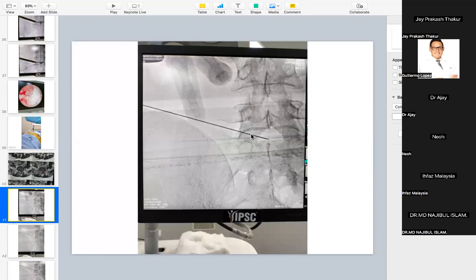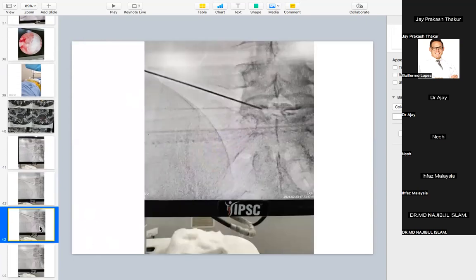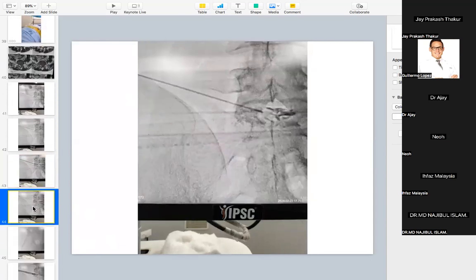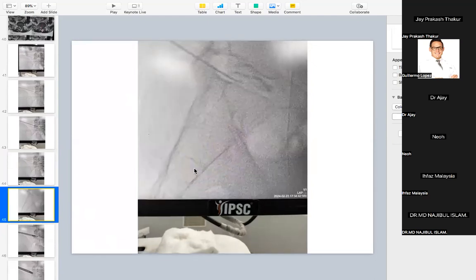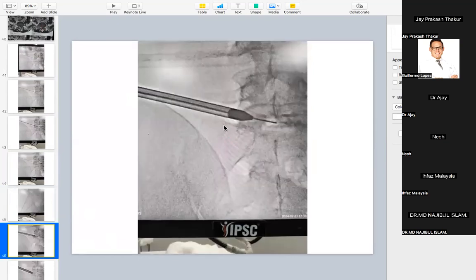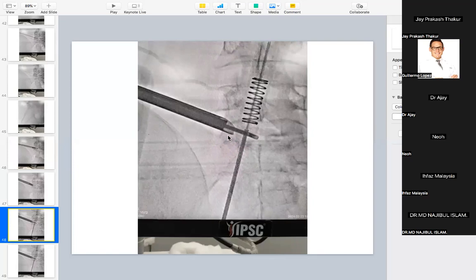Same thing we'll do. Okay, so midline, just above the ilium. Just above the ilium. Okay. Hit the SAP. Go inside. Do the arthrogram, discogram. Check lateral. Here is the posterior annulus over here. Dilator. Working sleeve. And now we start extracting from there.